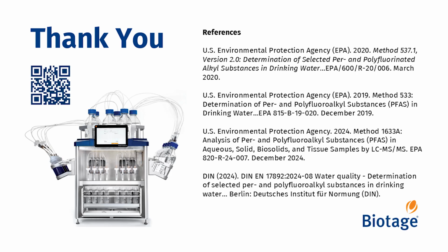We now have time for your questions. So, Evan, our first question is, how should a lab decide which automated platform best fits their needs? Yes. So I guess the question is more for the three systems that I showed in the very beginning, the Extrahera, the Prep Expert, and the Horizon 5000. And really the biggest thing first is your application. Are you looking to do SVOCs or PFAS analysis? Second thing would be your sample volume. So is it below 50 mL, or is it above 50 mL?